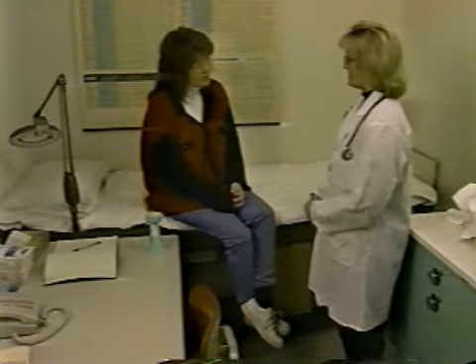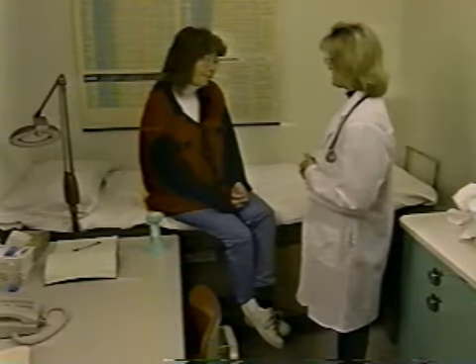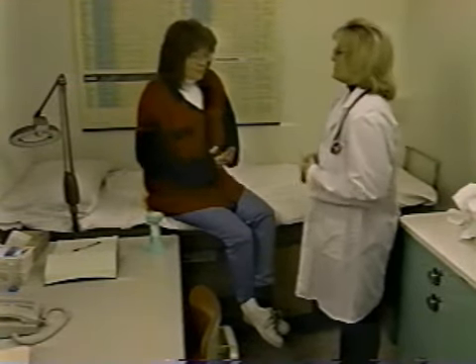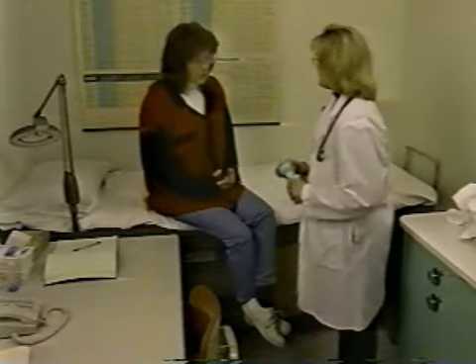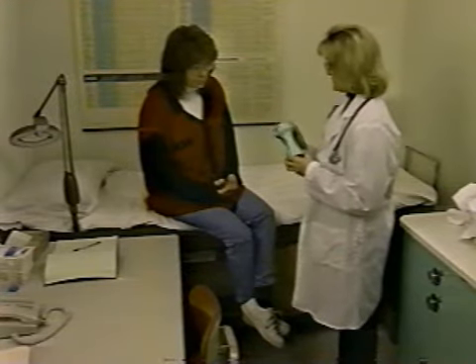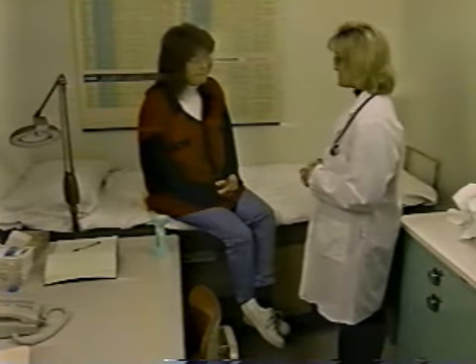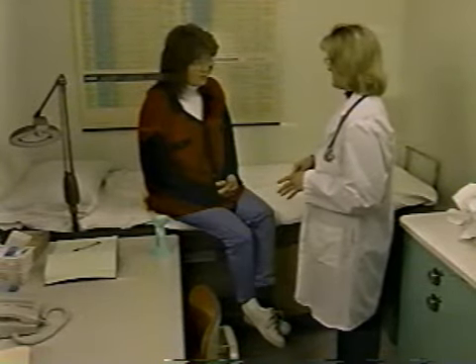Prevention of false positives begins with the careful collection of the specimen. Contaminating acid-fast organisms can be introduced into the patient's specimen during the collection process. It is essential, therefore, that all materials, reagents, and equipment used in collecting the specimen be sterile and free of contaminating organisms. Contamination during collection could result in early mismanagement of the patient. Such contamination could be reflected throughout the testing process and could result in a lot of unnecessary testing.